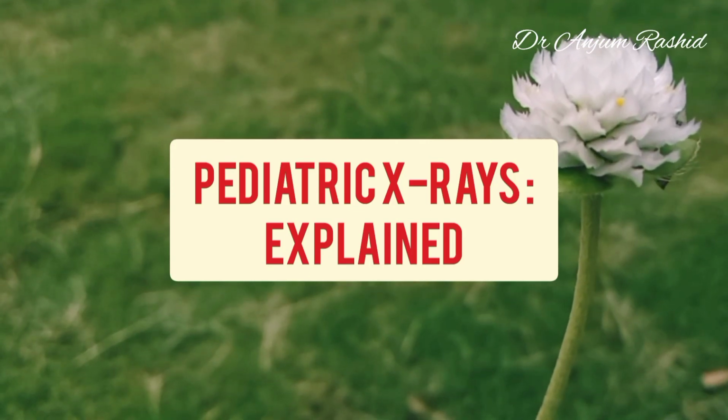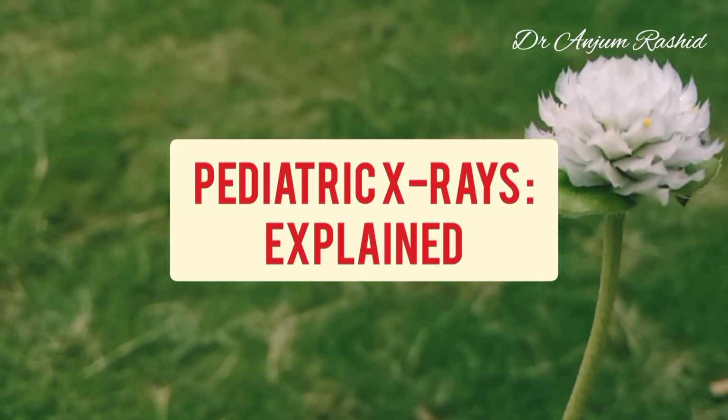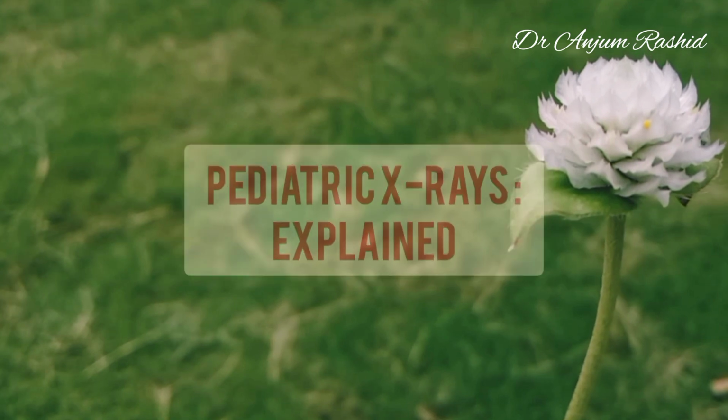Welcome to Pediatrics and Neonatology. This video is about childhood and neonate X-rays.